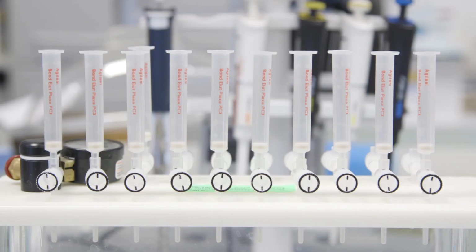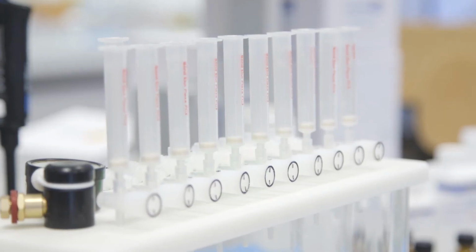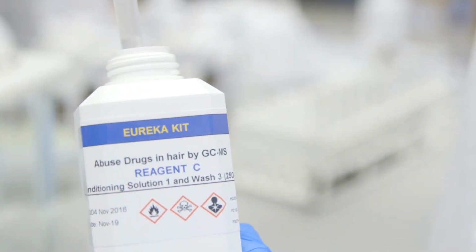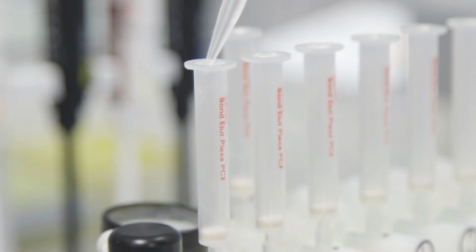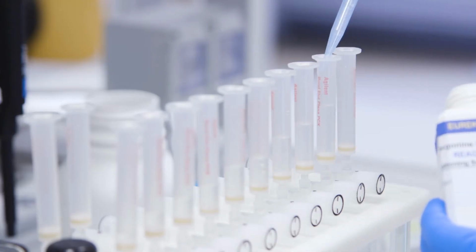Everything is ready to go with the conditioning of the SPE columns. We prepare a number of columns that correspond to the sum of calibrators, controls and unknown samples. To each column we should add 1.5 ml of reagent C, conditioning 1 and washing solution 3. We pass all reagents through the column and we discard the eluate.